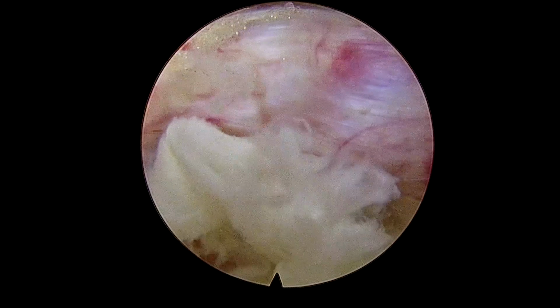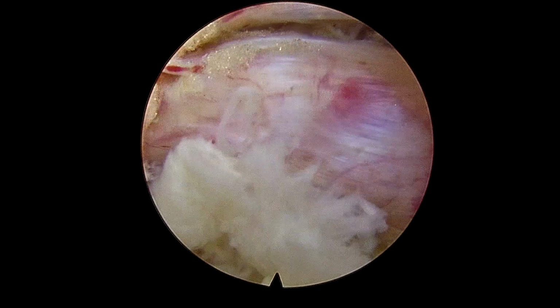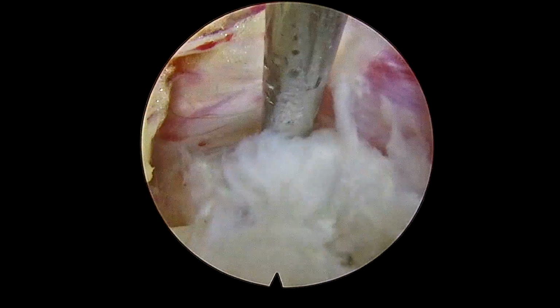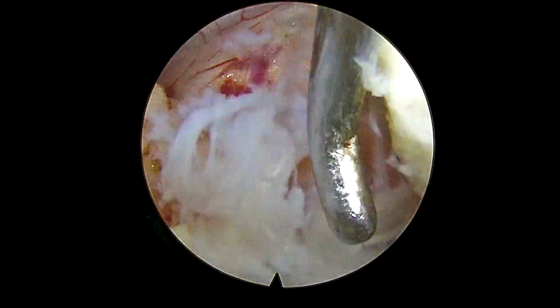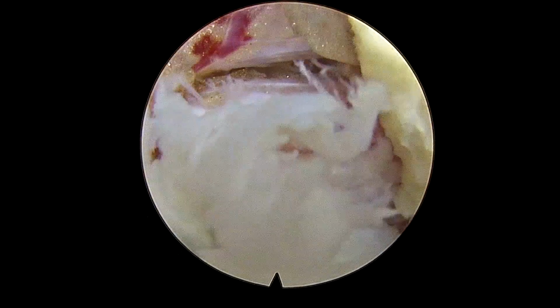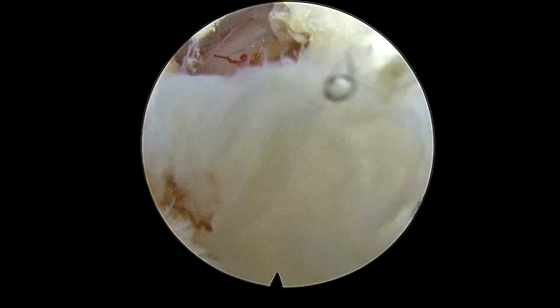So in all the cases of disc prolapse, whether it is a contained disc prolapse or a sequestrated disc prolapse, always try to debulk the fragment all around. To remove this fragment in one piece is very difficult, at least in a young patient with these subannular contained fragments. But you should at least try for it. This is the sticky fragment. I don't think it will come in one piece.